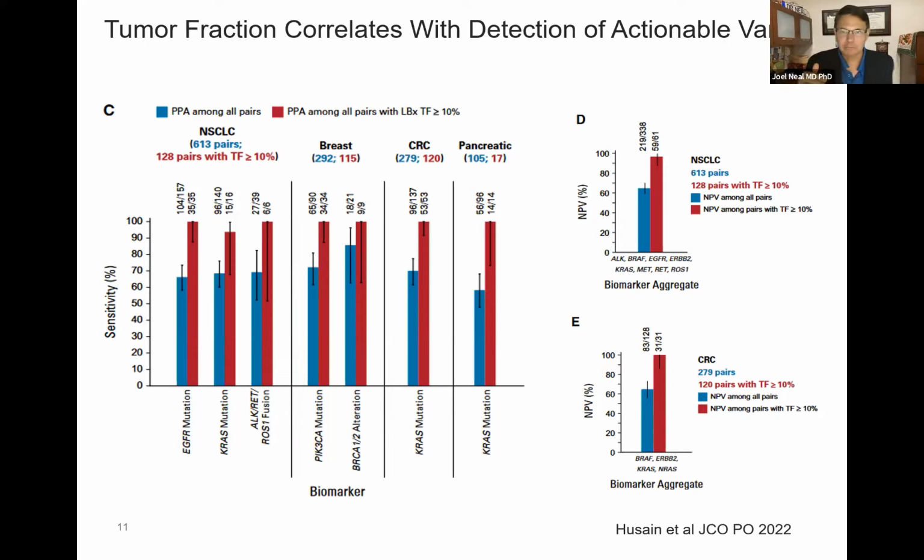And then page 2, the variant allele frequencies of everything, and maybe the certainty around whether that came from cancer would be useful to me. And then the next 30 pages can be clinical trials that I never look at. No, that's really important.